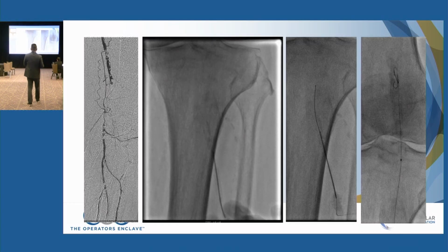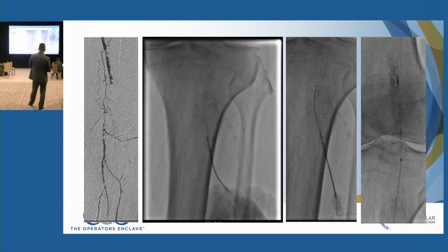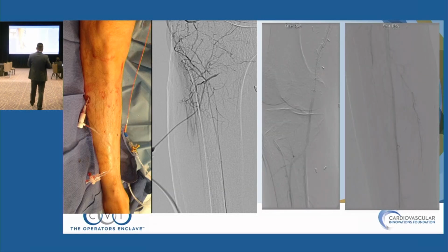Another way to do it, which is actually from Dr. Runback, is if you want to access the P3 segment, you can do it under fluoroscopic guidance, or I do it under ultrasound in this area. But he did fluoroscopic, so he's basically following the landmark, right on top of the calcium, puncturing in an anterolateral fashion through the tibiofibular ligaments, and you can get it up that way. Another way in this area, just to bring it up, is high AT access.